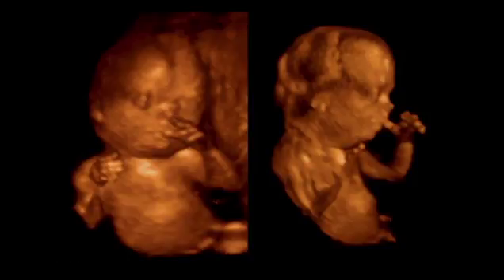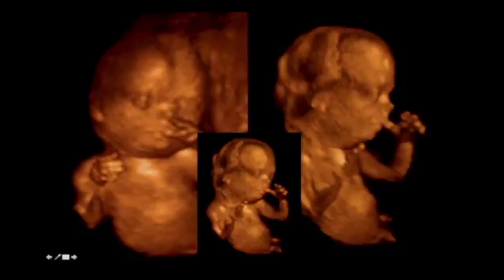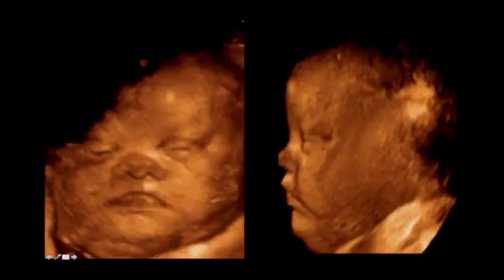Here's a fetus with Down syndrome, and you can see the rather flat face, the small ear, and the rather fat back of the neck area and round face that fetuses with Down syndrome have. This is a third trimester fetus with Down syndrome, showing again the flat face and very small nose that these fetuses typically have.